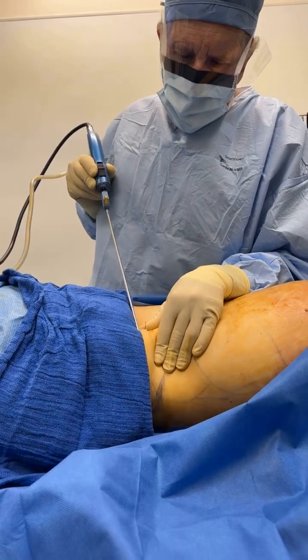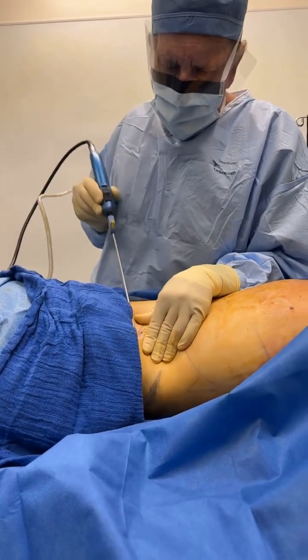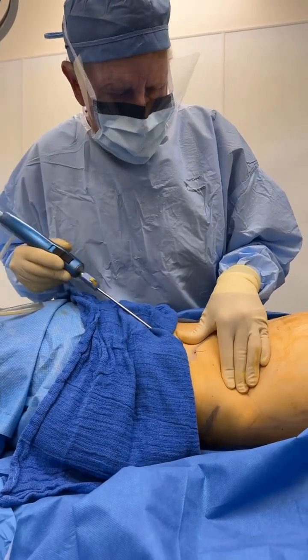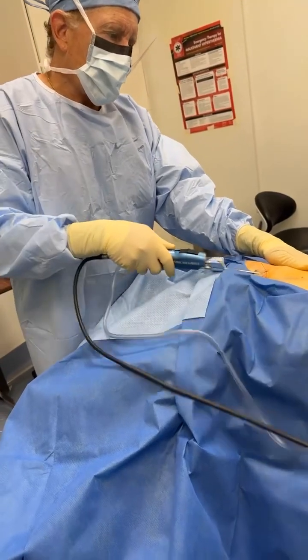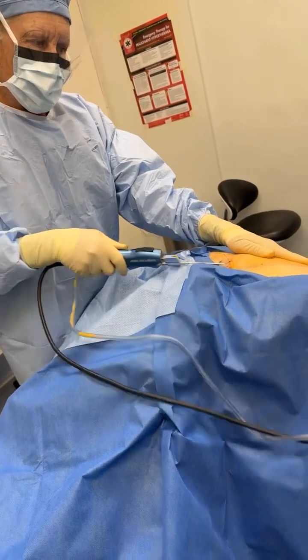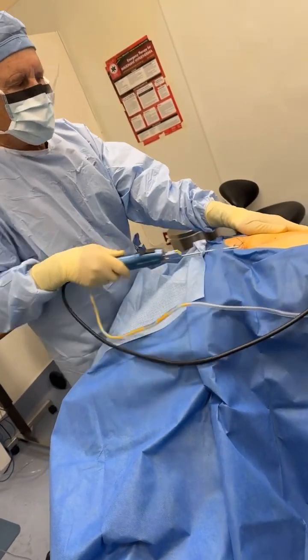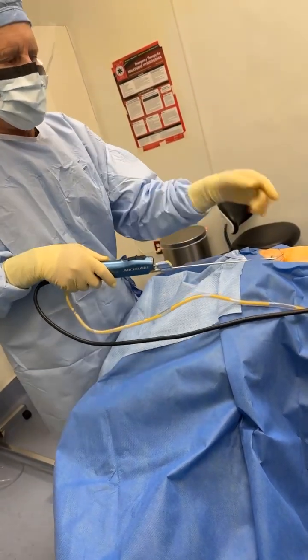And also, notice how slow I go. If I go slow, there is a much less risk of me perforating an internal organ, right? Why? Because it's similar to driving. If you go slow, like I am, you can still crash, right? But what are the chances? Much less risk. So it's not like there is no risk of bleeding or hematoma or infection. There is a risk, but much less, right?